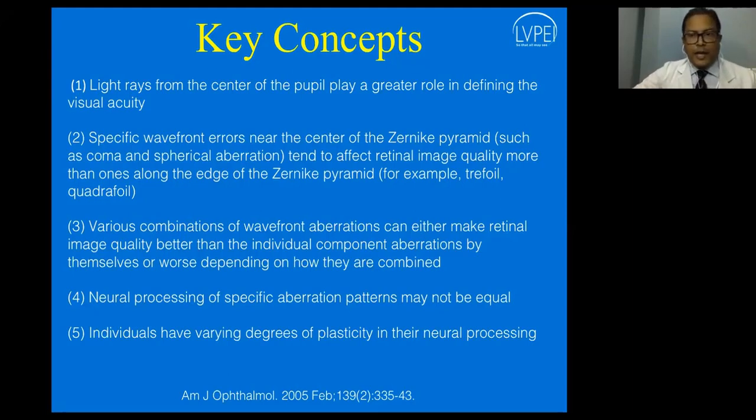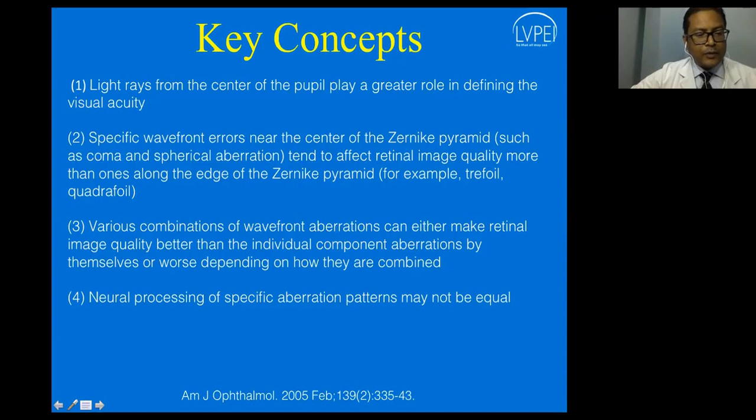Okay, so the Zernike pyramid is actually, as discussed in a couple of slides earlier, when we try to fit the aberrations by mathematical models, we can use several analysis techniques. One could be the Fourier, the Taylor, or the Zernike. As the way the rays get diffracted becomes more and more complex, the mathematical models for the wavefront increase exponentially. So in perspective, this is the Zernike pyramid that we had discussed some slides ago. For your reference, let me just go back to that.